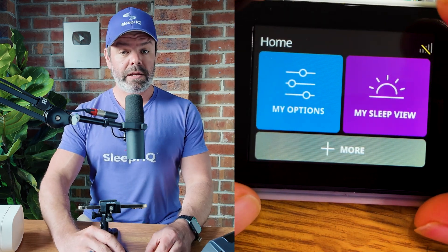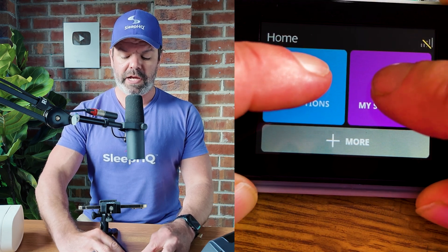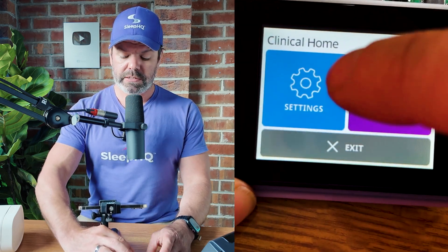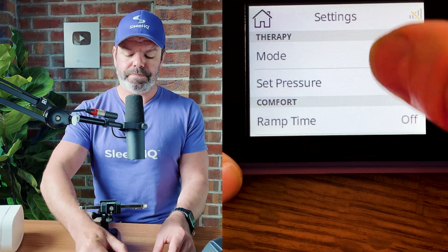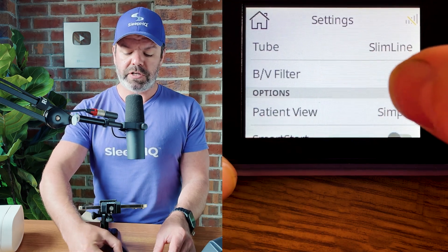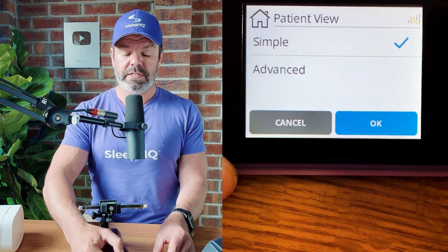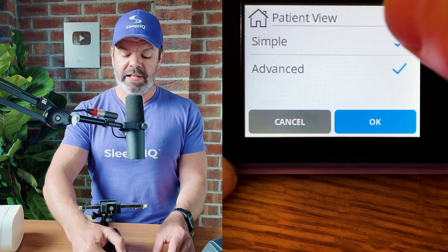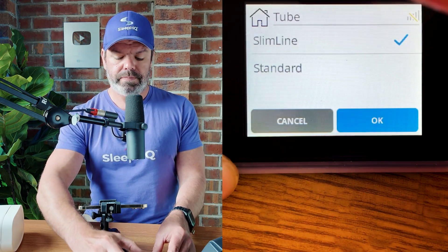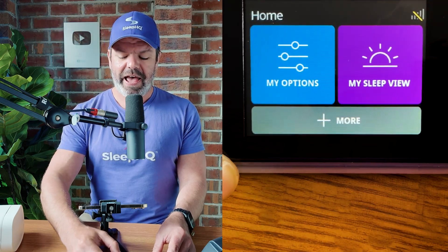Now we're going to access the clinical menu. To do so, just press and hold down anywhere on the screen with two fingers simultaneously. There we go — Clinical Home. We'll go into Settings, swipe up, and here it says Patient View. Tap Patient View — you can see currently Simple is selected. We're going to select Advanced, then tap Home at the top to exit.